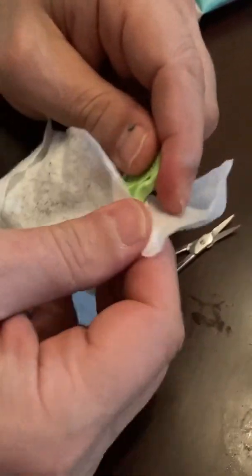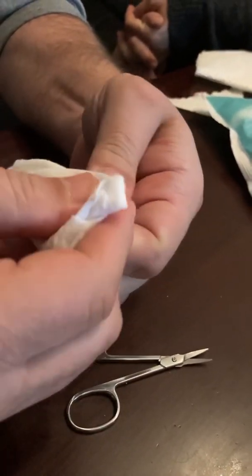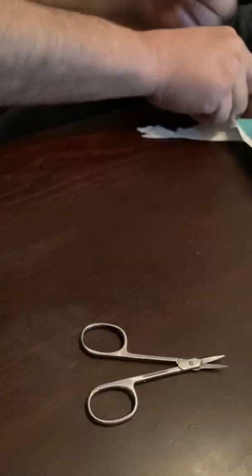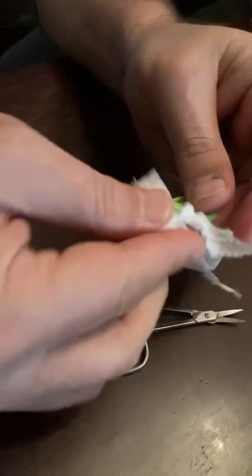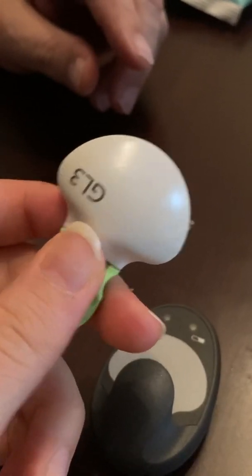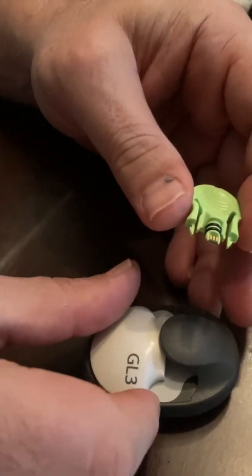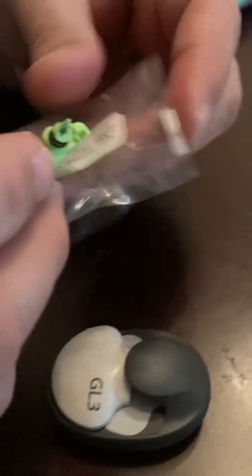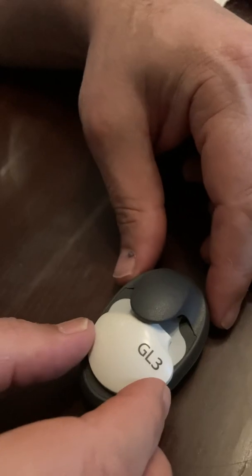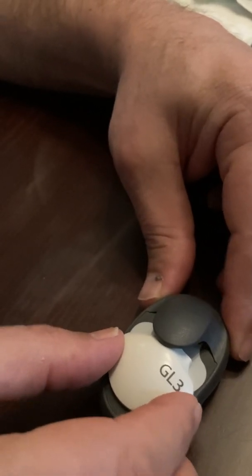Now we're cleaning it. We cleaned it with a wet napkin and now we're going to dry it with a normal napkin. Once you're totally sure it's clean, you can remove this protective apparatus and connect it with the charger. Make sure your hand is straight and the transmitter is straight, in a firm and flat position.